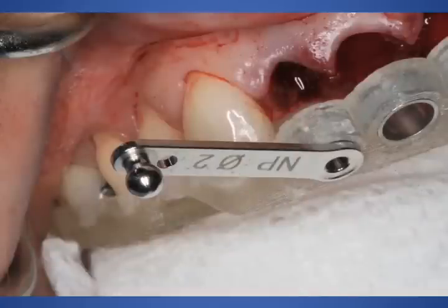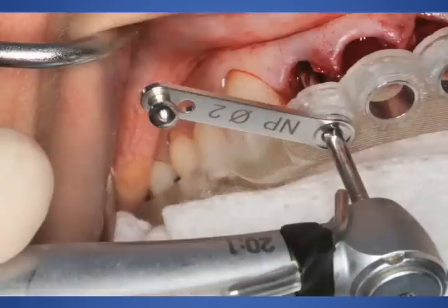Now we're using different keys with the Nobel Guide system that will allow us to initially do our 2mm pilot drill to the correct depth. Now, these surgical guides are very precisely made, and they increase the distance from the crest of the bone to the top of the surgical guide by 10 millimeters. So our surgical drills need to be compensated for this extension of the surgical guide itself.